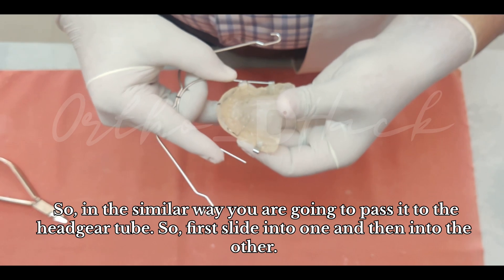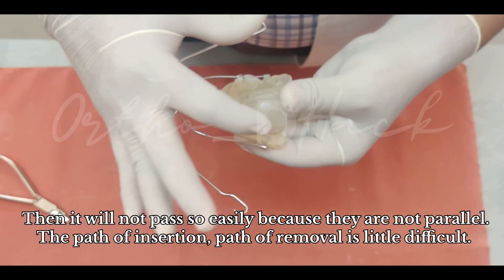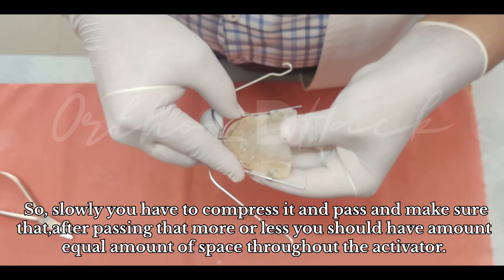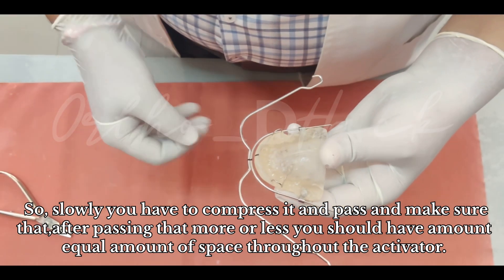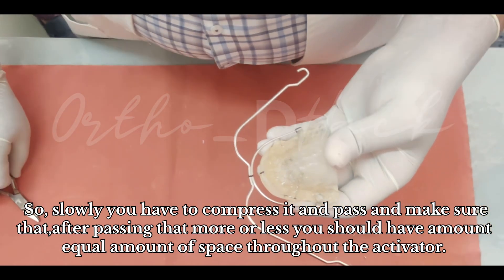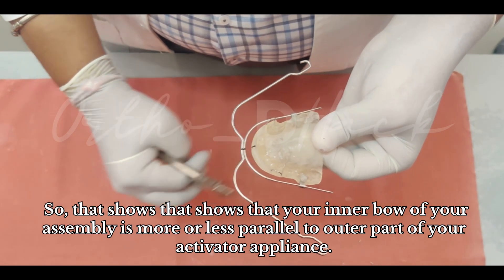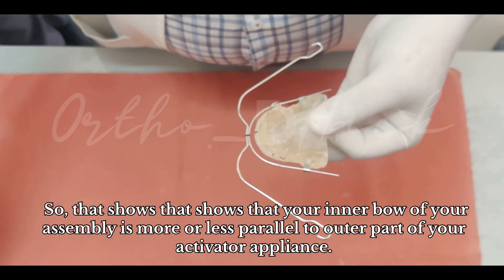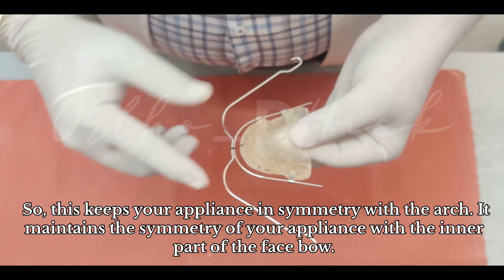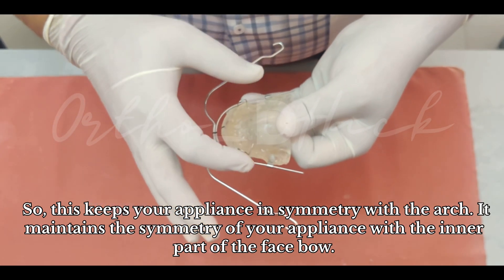First slide into one side and then the other. It will not pass easily because they are not parallel — the path of insertion and path of removal is a little difficult. Slowly compress and pass it, making sure that after passing, you have a more or less equal amount of space throughout the activator. This shows that your inner bow assembly is more or less parallel to the outer part of your activator appliance.